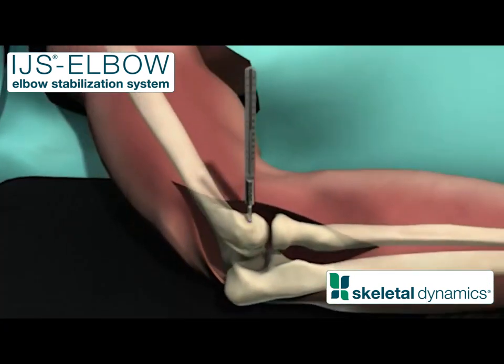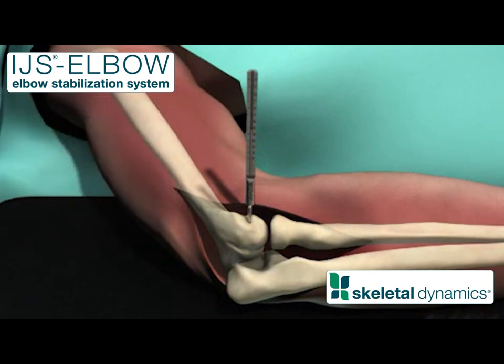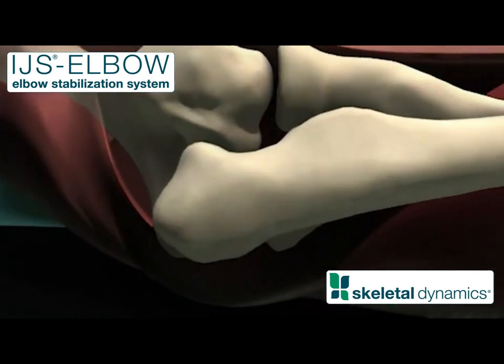Once confirmed, advance a depth gauge over the K-wire and note the expected axis pin length. Remove the depth gauge and advance the 2.7 millimeter cannulated drill over the K-wire to the measured depth.